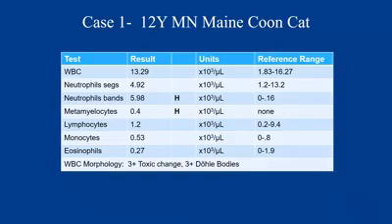All right. We also had small numbers of metamyelocytes, which are a neutrophil precursor. That's kind of the step before our bands. Okay. So we had a pretty notable left shift in this patient, whether or not you want to classify it as regenerative or degenerate, that's up to you, but a notable left shift that our analyzer couldn't have identified, okay?